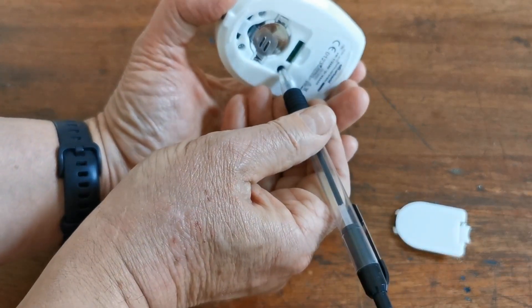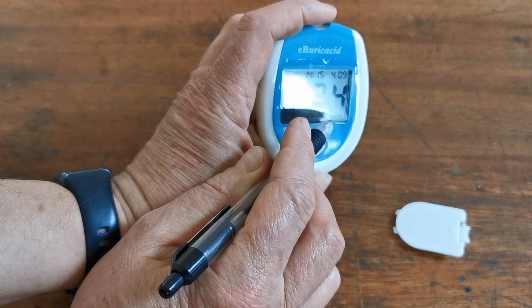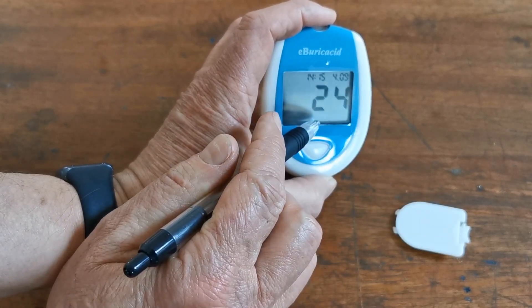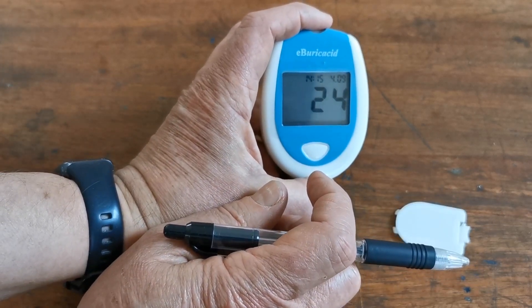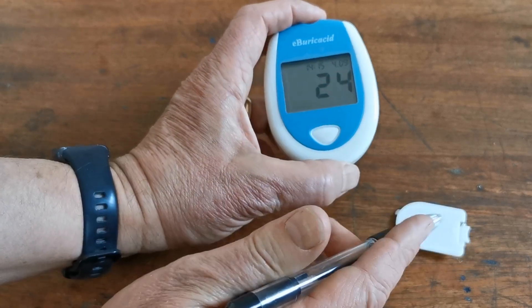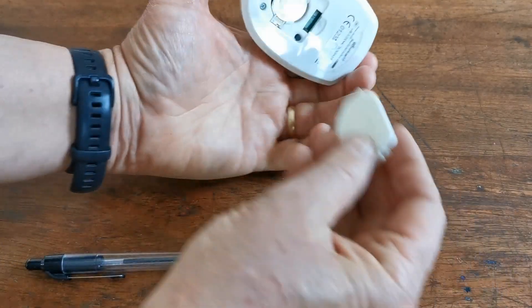When you're happy with the time and date, press again and you'll see it flashing at the bottom — milligrams per decilitre. Hold the front button to switch to millimoles per litre, and hold it again to go back. You can select which scale the results will be displayed in. For UK users we usually recommend millimoles per litre. When you're happy, press again and it will power off. This meter is now fully set up.